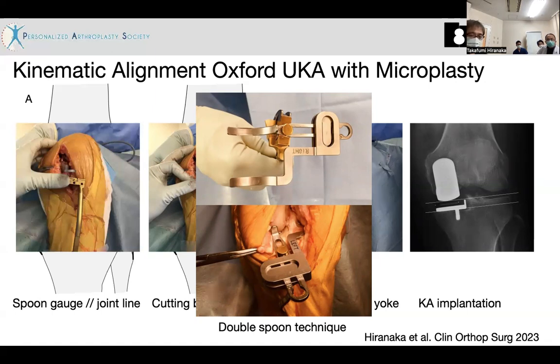But this curve is very difficult because sometimes it impedes the patellar tendon. So I am now redesigning this curve and shape. Anyway, in the near future, I can use this one in all cases.